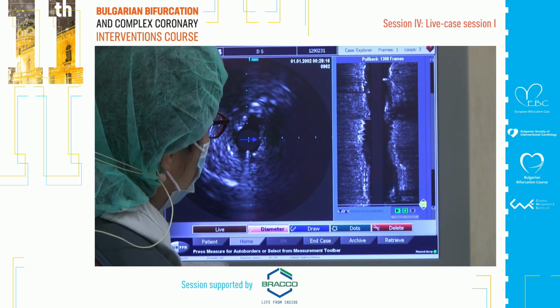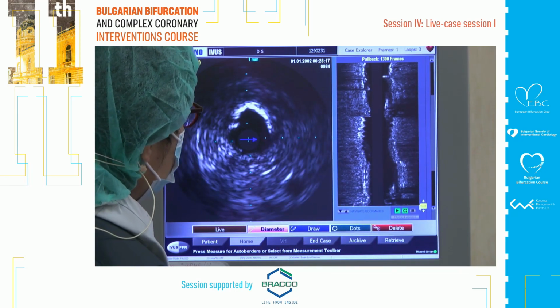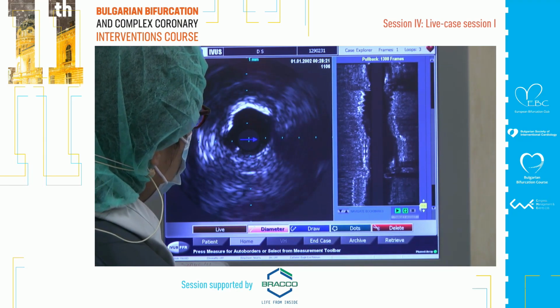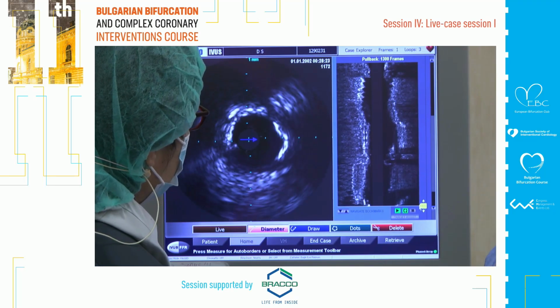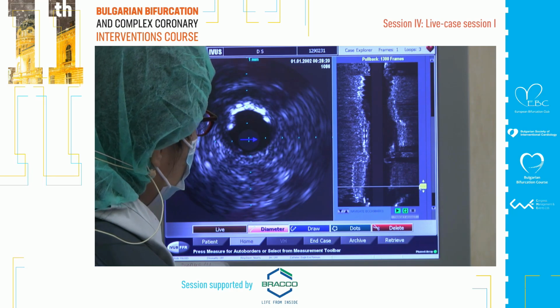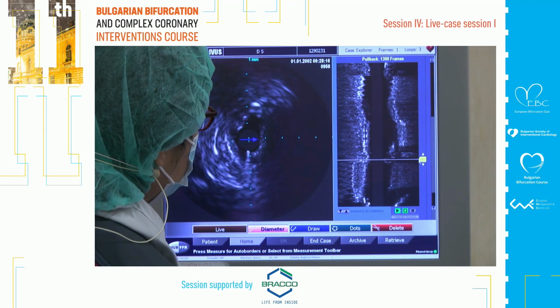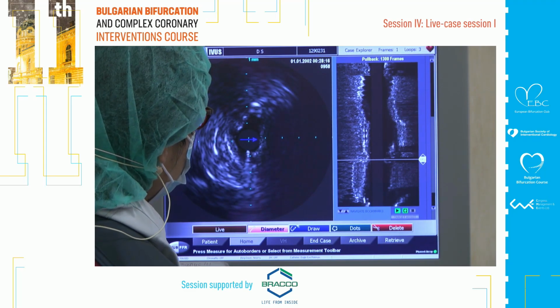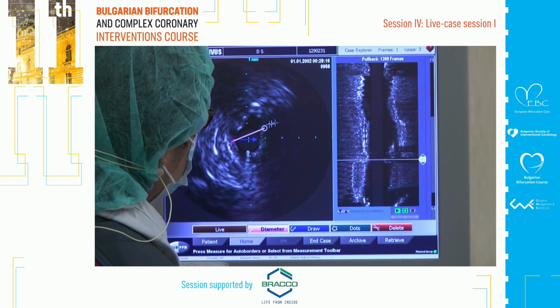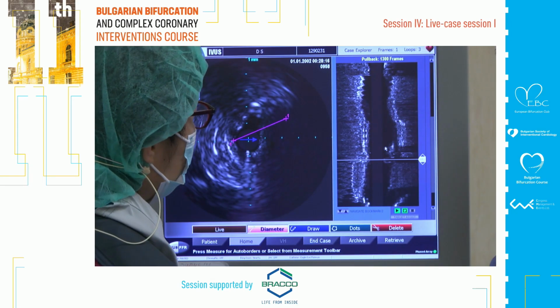And then we go back to the proximal. This is what we saw before. This is the proximal LAD. And then come back. This is a circumflex, and this is a left main. So I think the recommendation is starting here to land. But before, you should make a good ballooning of this portion. And the diameter of this portion, media to media, is about 3.4. So maybe 3 or 3.5.